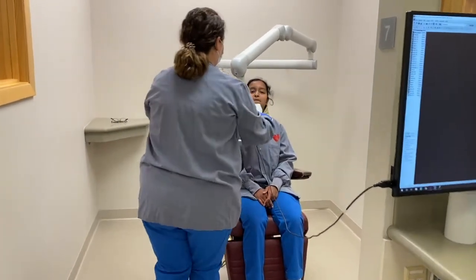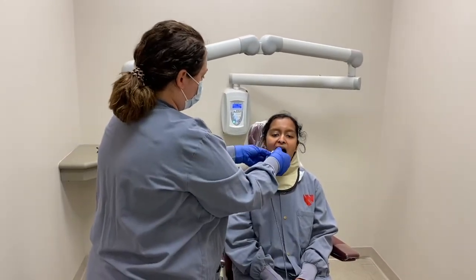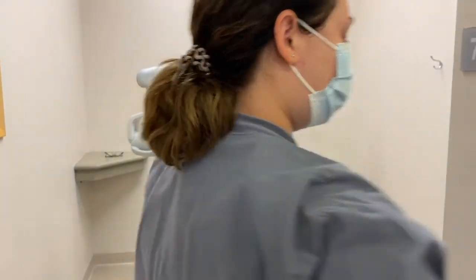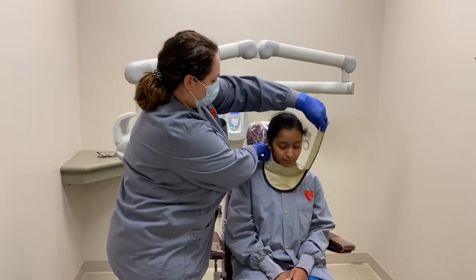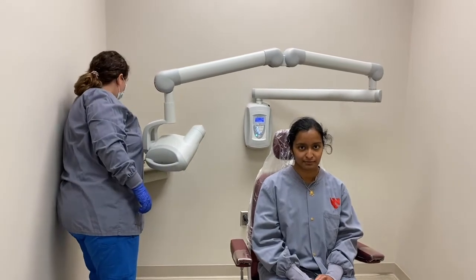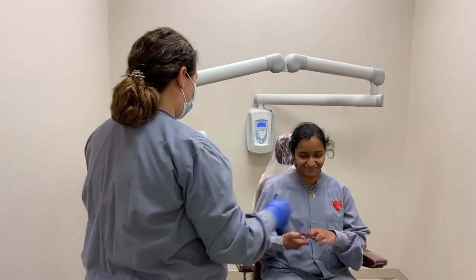After capturing the correct image, you can remove the receptor from the patient's mouth. Remove the thyroid collar from the patient's neck and return all items such as glasses and dentures. Instruct the patient to wait for you in the waiting room until you clean up the area and are ready to go back to the clinic.